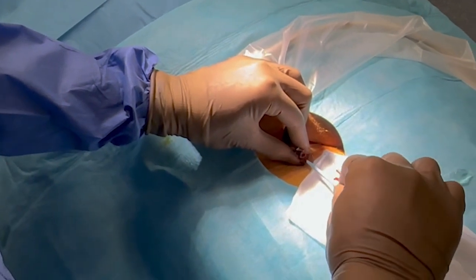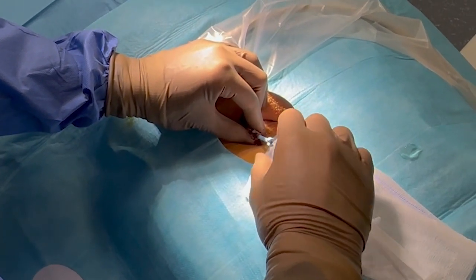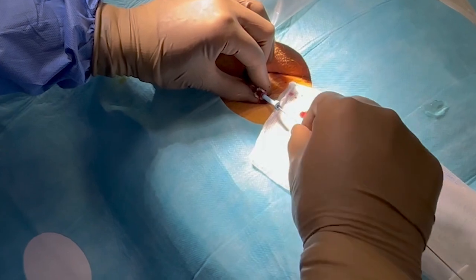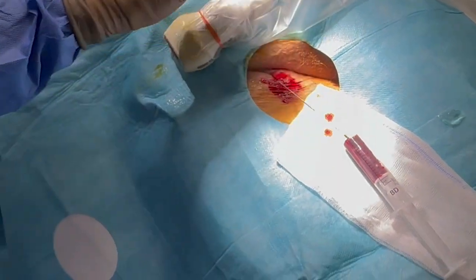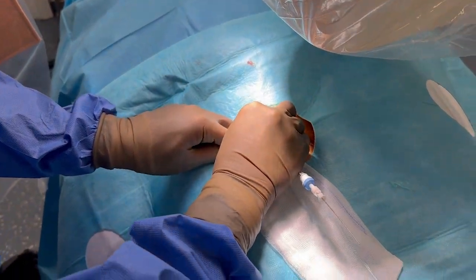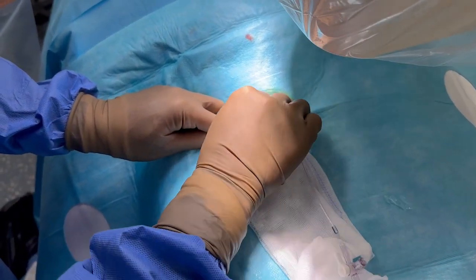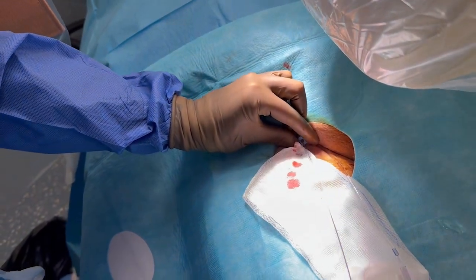The guide wire introducer tool may assist in advancing the guide wire into the needle. Be careful when advancing the guide wire — there should be limited to no friction during introduction. A dilator and introducer may now be advanced over the guide wire. In case of doubt, check with echography whether the guide is within the femoral vein.